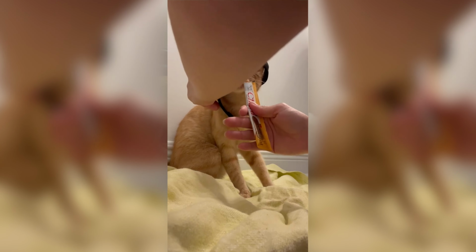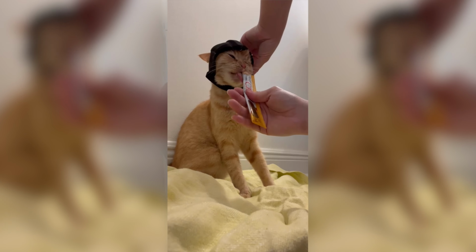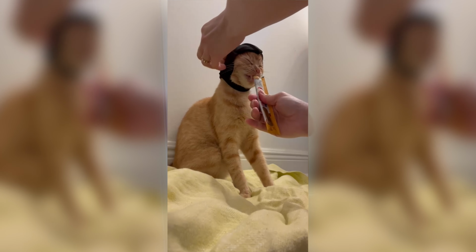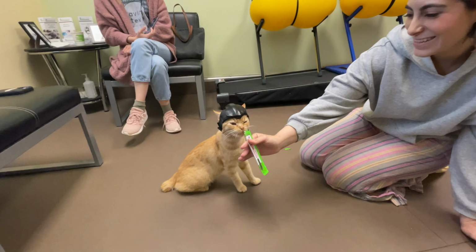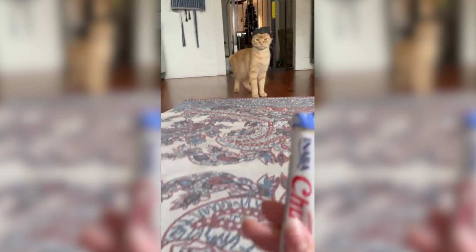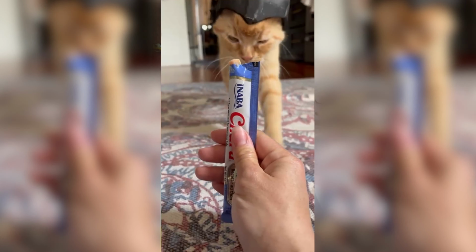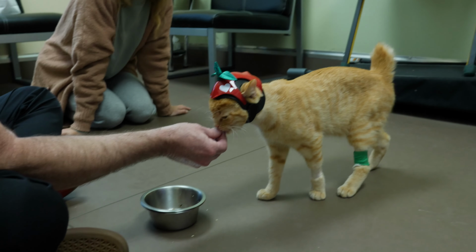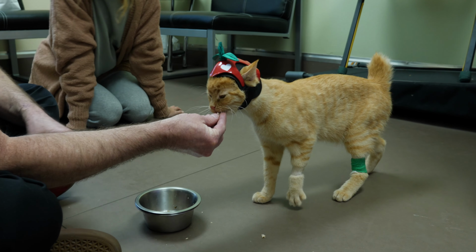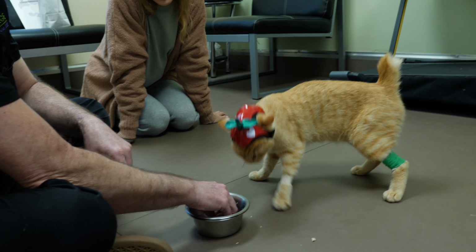If we can continue getting him to wear it for longer and longer periods and positively reinforce him for it, then he could potentially wear it all day and night and never have to take it off if he was that comfortable with it. So the whole goal was to make this helmet a true positive thing in his life, so that anytime the helmet came out, he knew he was going to get fed and get these wonderful rewards.